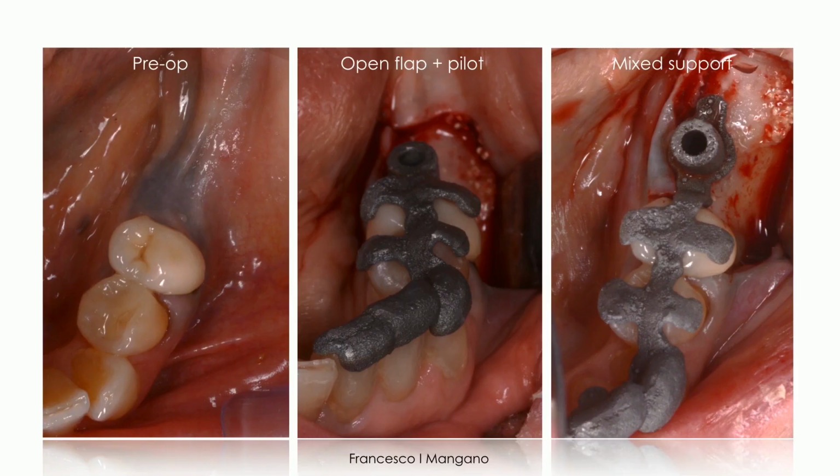And the guided surgery proceeds very easily and fast. The surgeon can open the flap because the stabilization of the guide is given by the teeth, but at the same time by the bone, because that cylinder is exactly segmented over the bone. So once again, if we perform segmentation in SMOP, and it's possible, we can export the position of the bone.